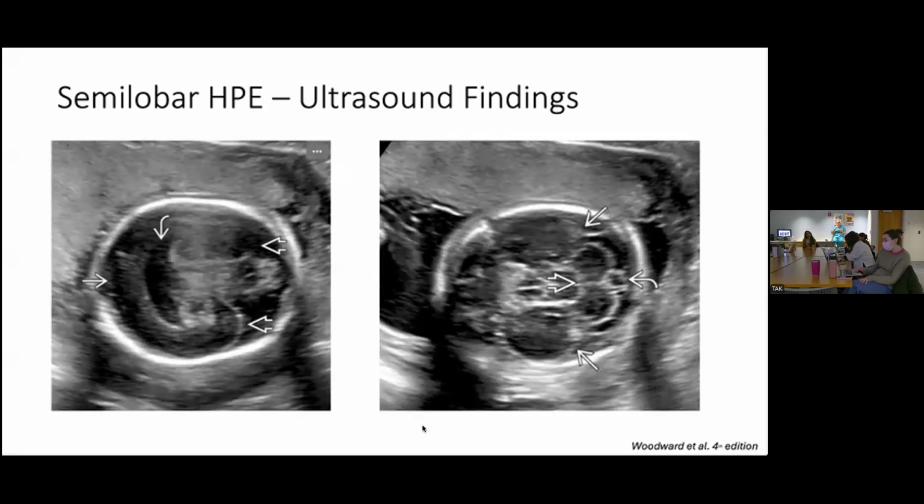A couple more images here. These are pictures of the same fetus. This was again at an anatomy ultrasound. This view is a little bit oblique, but there is an absent CSP. You can see the frontal lobes are fused. They are not separated, but you can see that the occipital lobes are separated posteriorly. And you can see this monoventricle. Again, this is just another angle. The parietal lobes here are separate. There's a normal cerebellum, normal cisterna magna, and then here there is partial fusion of thalami.